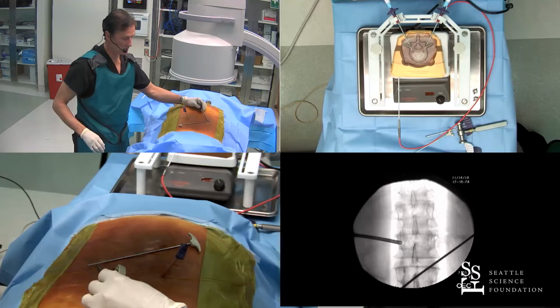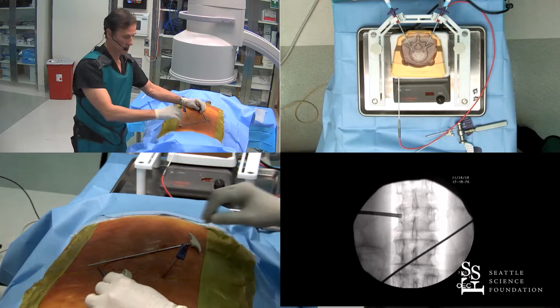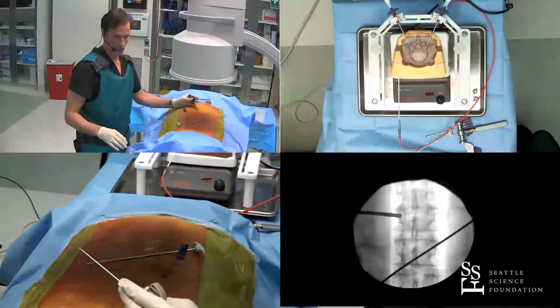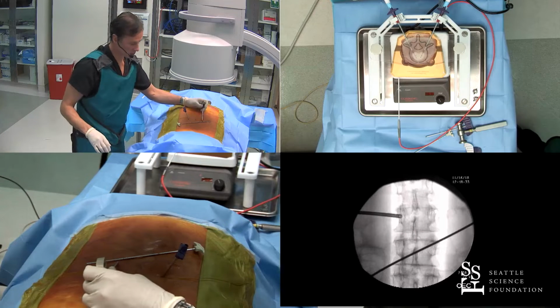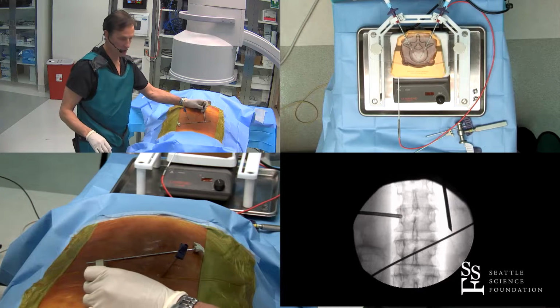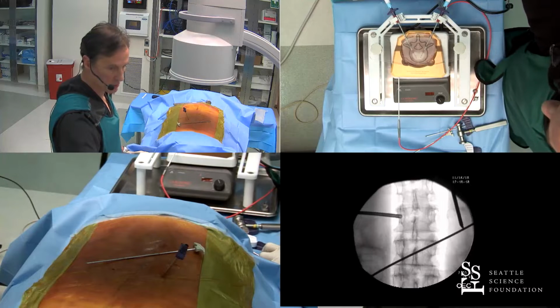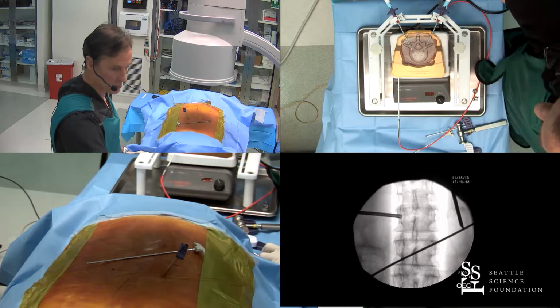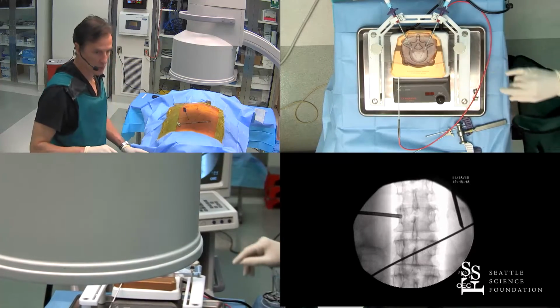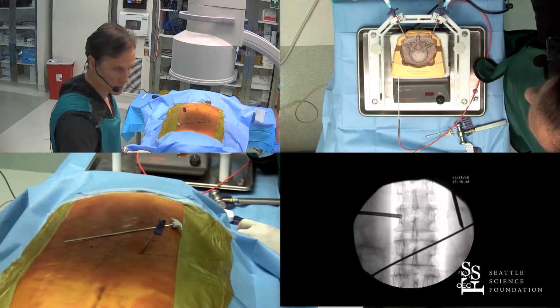And we're on a line from ipsilateral superior to contralateral inferior vertebral corner on this line. And we're going to go one vertebral body width out along this line. So about right there. So we're aligned for ipsilateral superior to contralateral inferior vertebral body. We're going to go one vertebral body width out, and that's going to be our start point here.